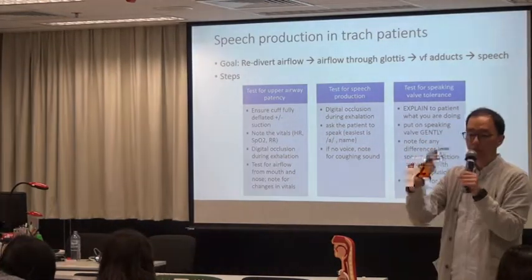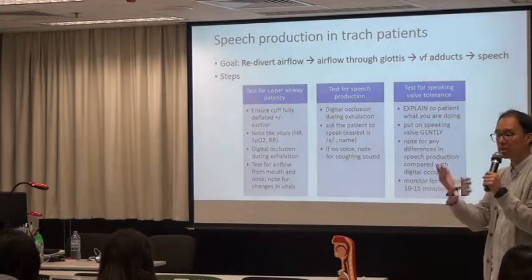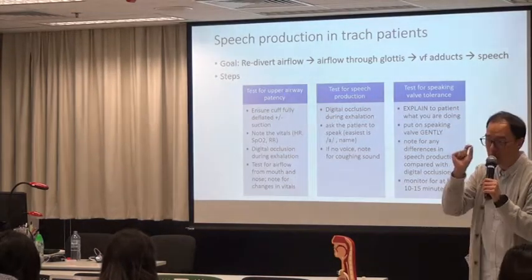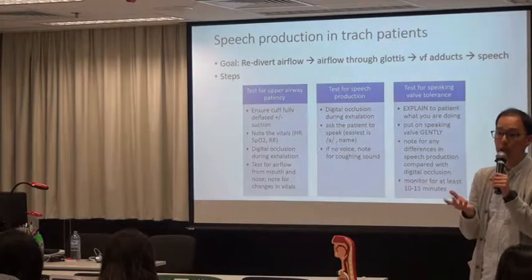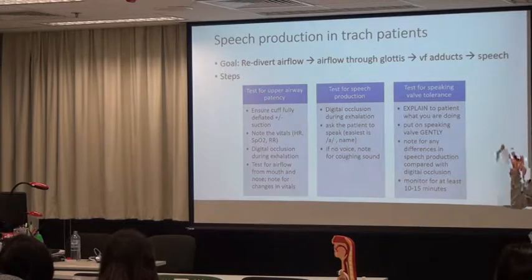Okay, with air not being able to come out through the tube here, you can talk. OK, 咁你就話俾佢聽帶出嘅聲範咧，你就唞氣嘅時候，可能吸氣會有少少辛苦。呼氣都會有少少辛苦嘅，不過就可以令我哋講得到嘢可以傾到偈。And then the second thing, put on the speaking valve gently.